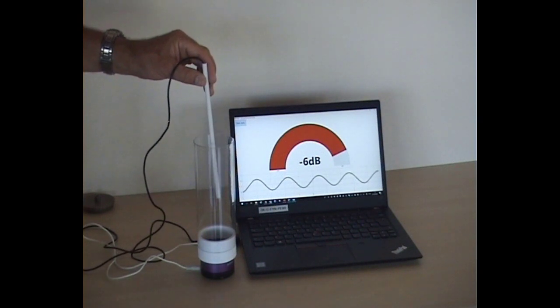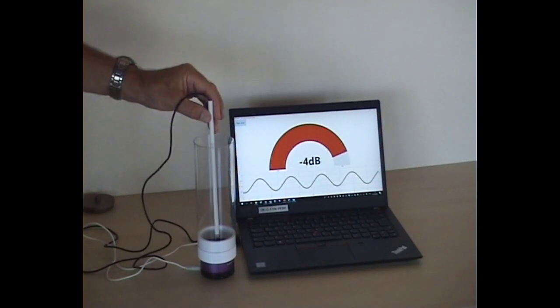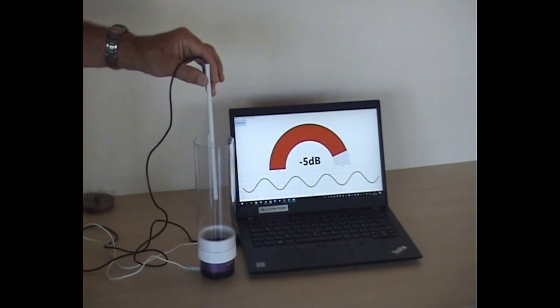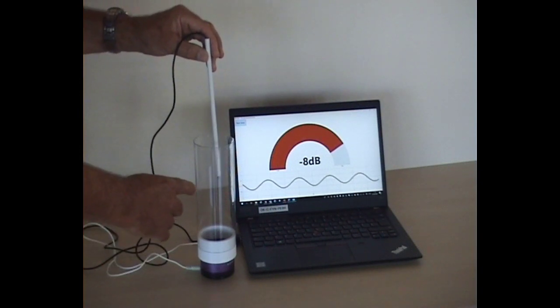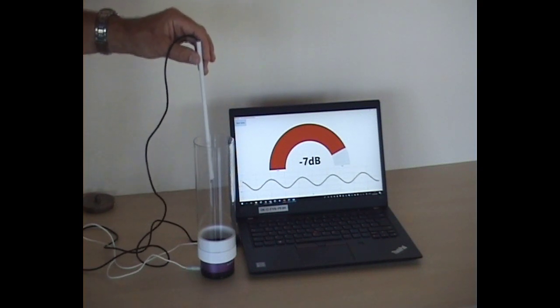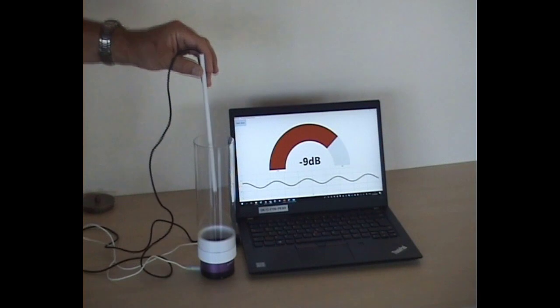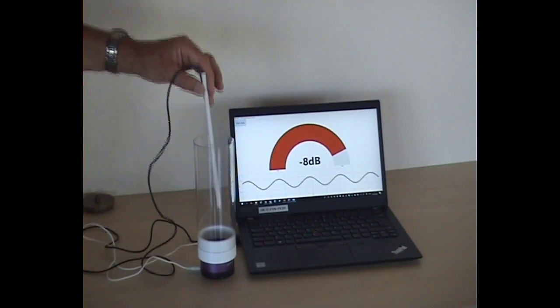And again, it's fairly intuitive, because basically rather than being able to radiate into a big space around the loudspeaker, we've constrained the sound pressure wave into a parallel tube. So the pressure wave is relatively constant along the entire length of the tube. Gradually, as we get further away, the acoustic transparency of the material I've used for that ear canal begins to affect the pressure wave, and it begins to reduce. But essentially, we can say it's fairly constant along the entire length of the ear canal. That's great, isn't it? That's kind of exactly what we're after, really. So we put a sound in at one end, and the same sound ends up at the other end of the ear canal.